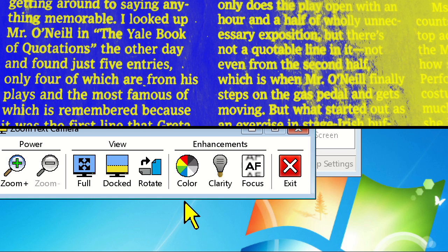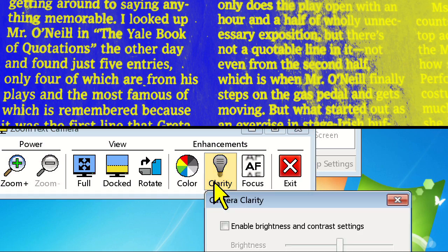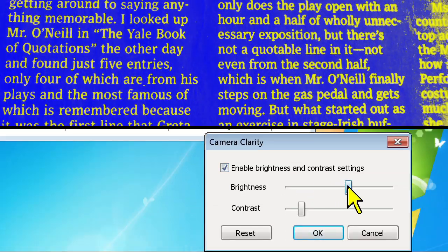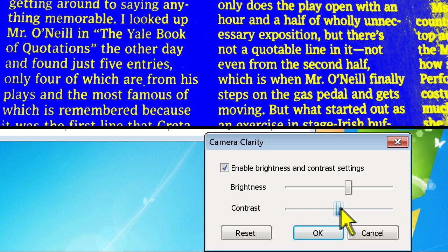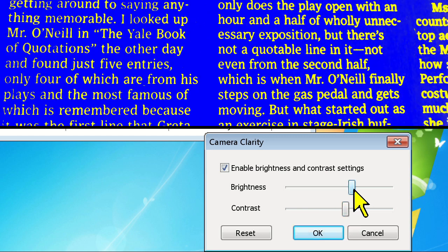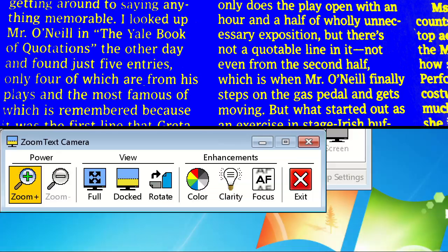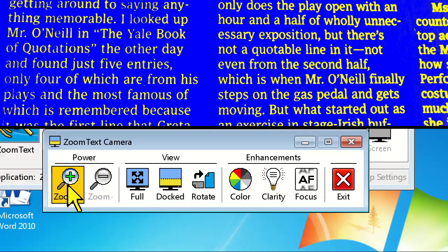Click on the clarity button and check the box to enable brightness and contrast setting, and then we'll adjust the brightness control first, and then move on to the contrast control. This will allow for very bright whites and dark black colors on screen.